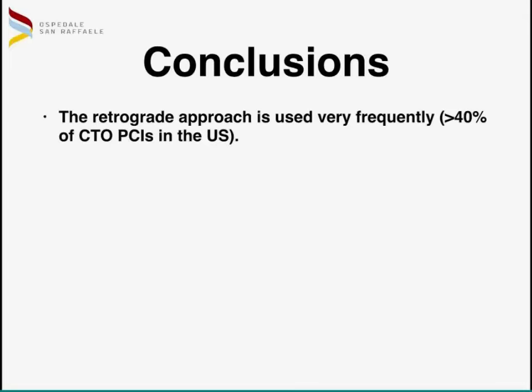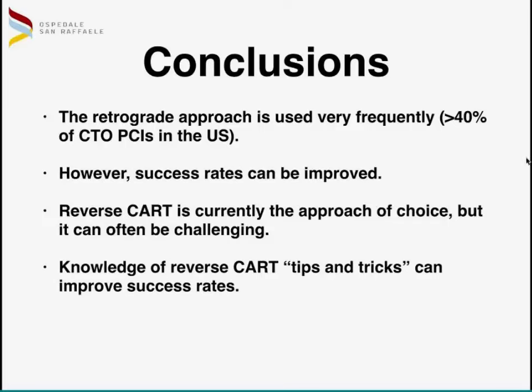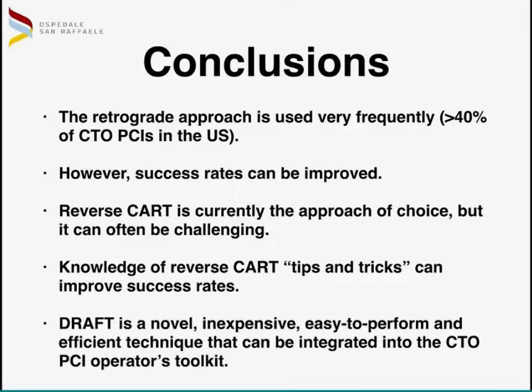Well, in conclusion, I think that the retrograde approach is now used very frequently, more than 40% of CTO PCI in the USA, as you underline in a few papers you wrote. However, success rate can be improved. Reverse CART is currently the approach of choice, but it can often be challenging. The knowledge of reverse CART mechanics can improve success rates, and DRAFT is a novel, inexpensive, easy to perform, and efficient technique that can be integrated in the CTO PCI operator's toolkit.